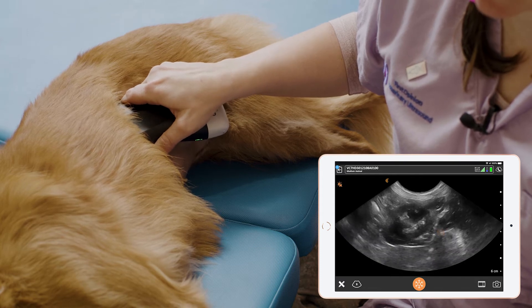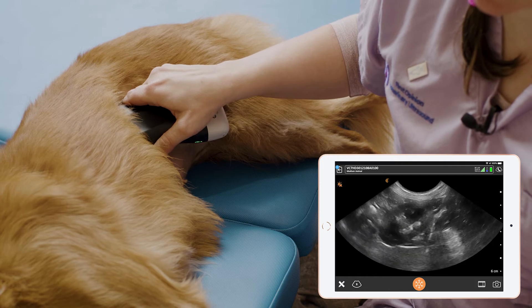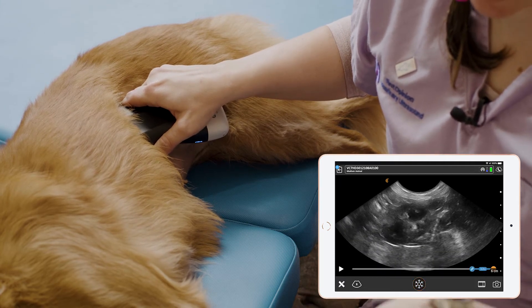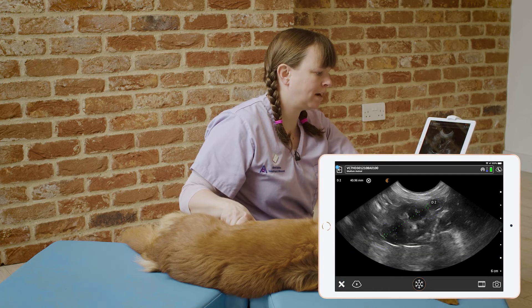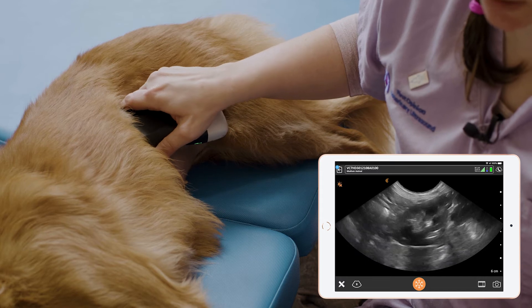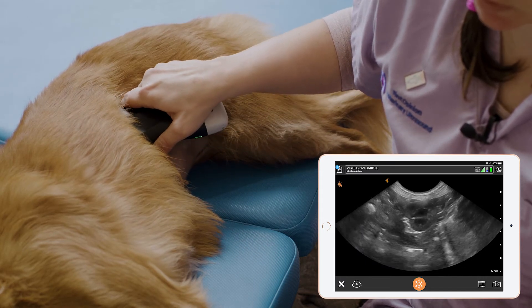Once we've made slight rotations to get the best longitudinal image we can, we can freeze the image and measure the length of the kidney from the caudal pole to the cranial pole.